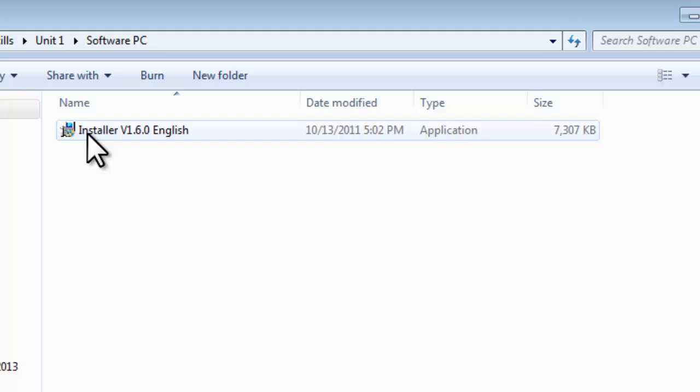We double click on the installer, and the program will be put onto your computer.